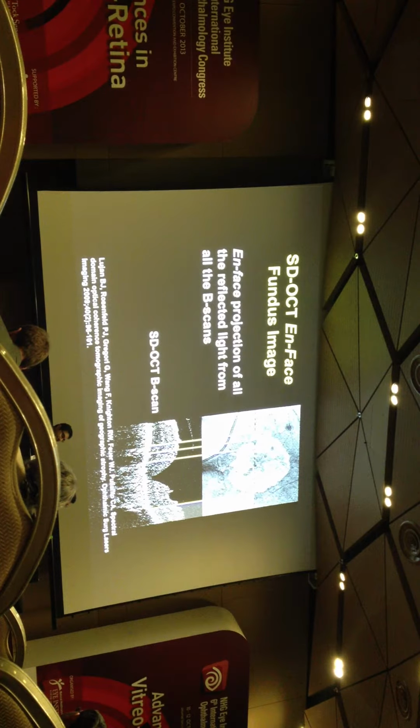So when all the light is reflected back to the detector, it appears brighter compared to where the RPE is intact. Okay? That's why geographic atrophy appears bright.